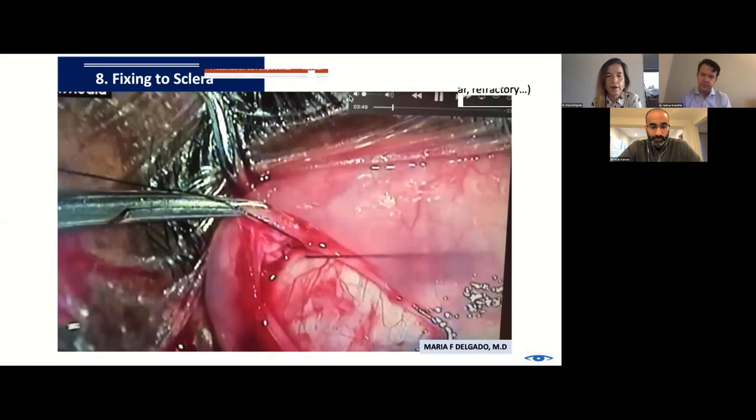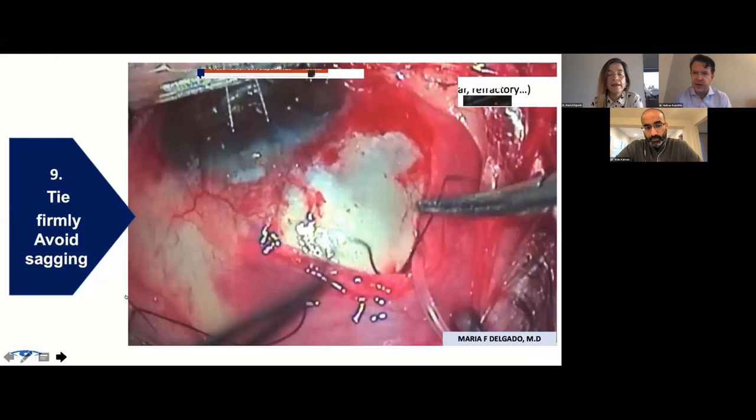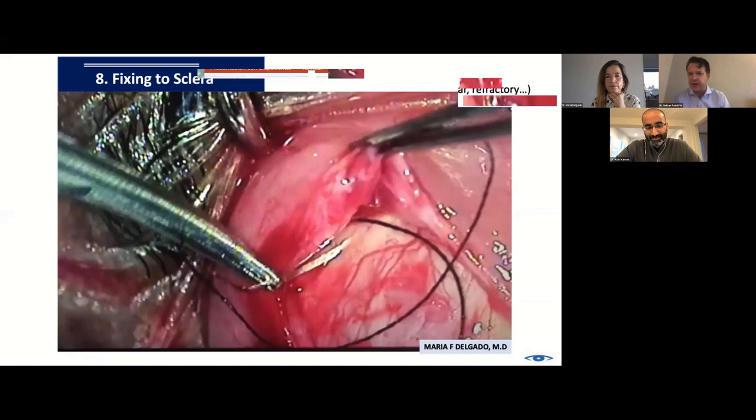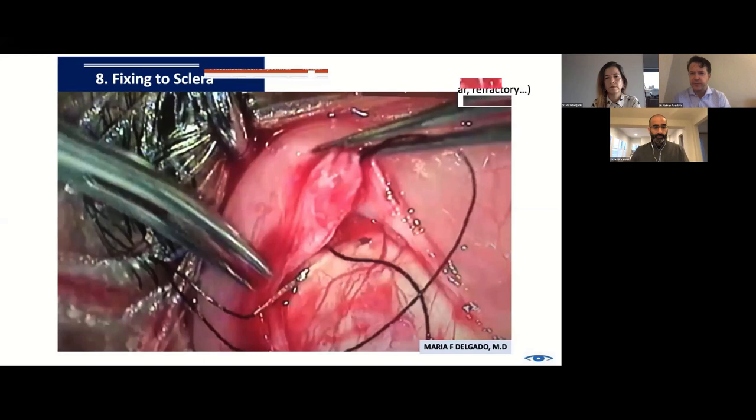You want to see that you're in the right place and at the good length that you want to be. And I really like that. That's a really great idea. I actually hadn't seen that before. Usually the surgeon's trying to suture through the plate, do the sclera. You add a lot of variables. It's tough to keep the eye in that position. And here you're making good control over the surgical field for ideal placement. And then you just simply slip the tube on later. It's great.